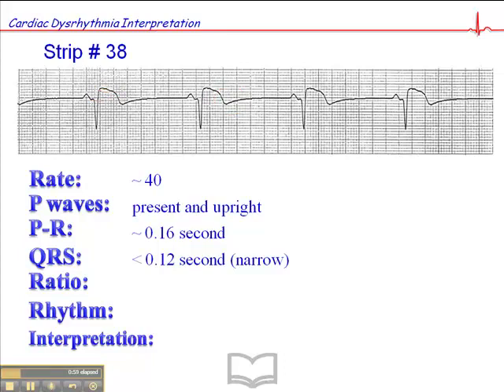So we have a narrow QRS complex, we have a ratio of 1 to 1, we have the rhythm which is regular.